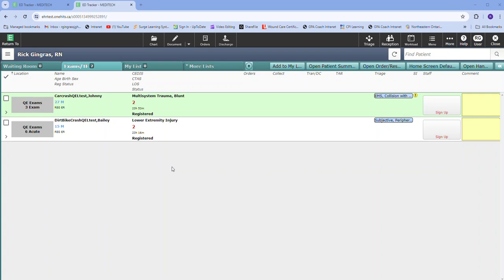PCA, guys, I want to show you guys how you document these. Okay, so at the end of your shift, you go to your pump the same way you always have. You zero your pump and you document your doses attempted, your doses given, how much was given PCA, and how much was given in total volume by the end of the shift. So here's how you document those things.